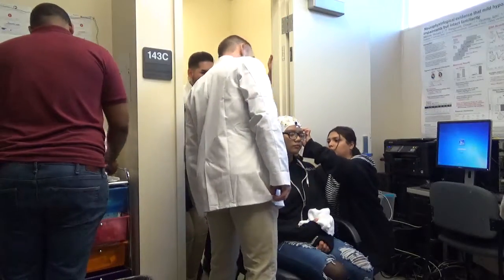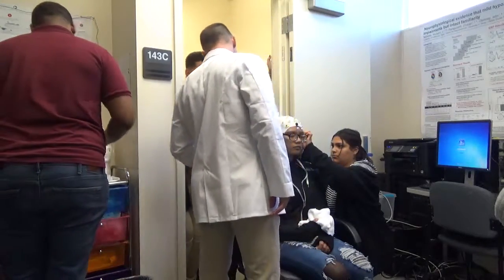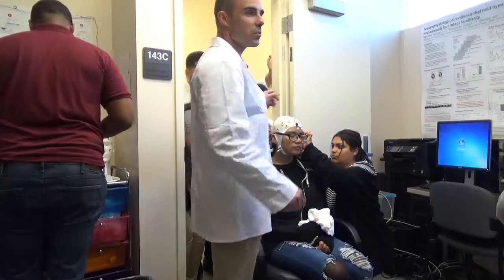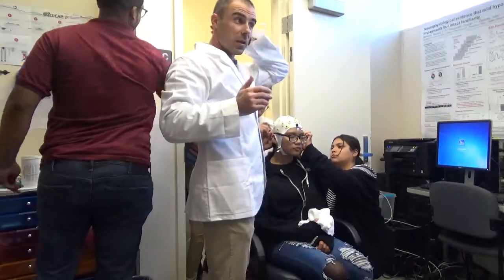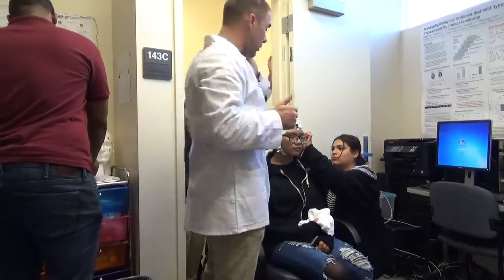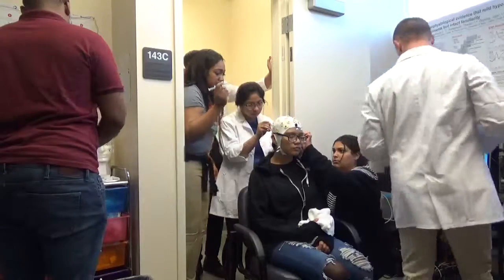This is pretty good, although they missed one spot here in the middle in the ground, but we'll get that later. With these back sites, you really got to move that hair into a channel, with the ladies who have that kind of ponytail thing. But usually you can get it, and it's usually not too much of a problem.